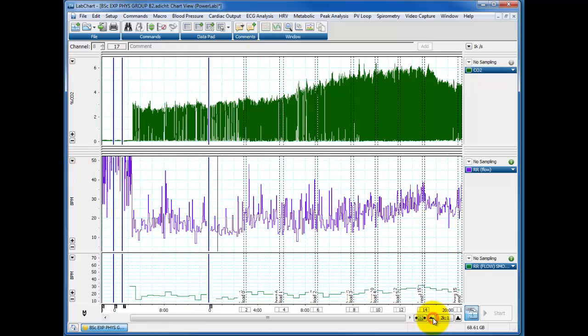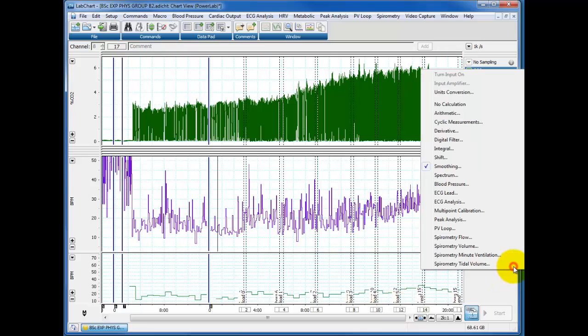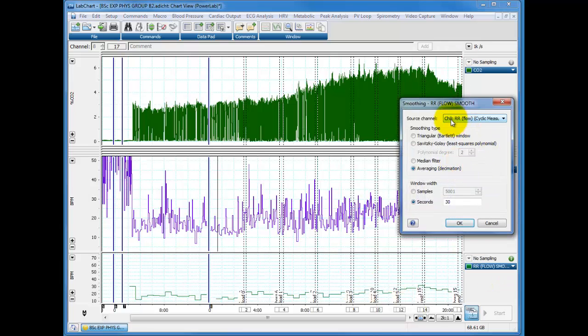And again, it shows a trend that respiratory rate is increasing from about twenty to about thirty over the course of the practical. And because this one here, the smoothing was set up to work from the channel eight, irrespective of what the channel eight was actually doing, it's also managed to bin our data from these new analyses.